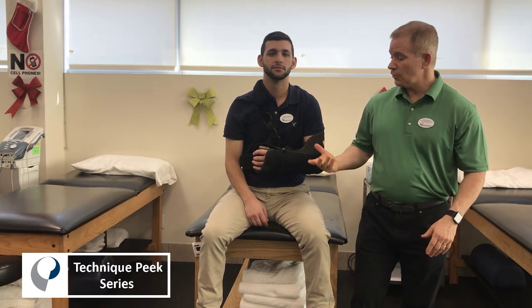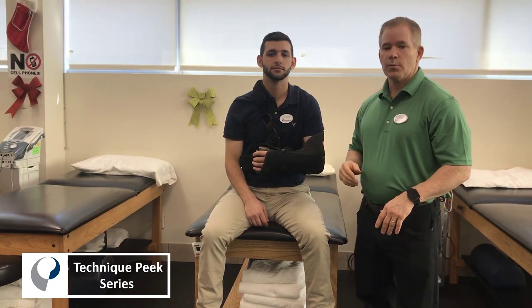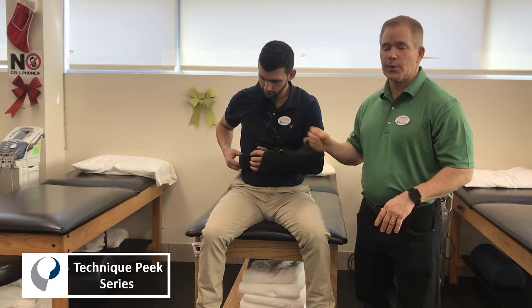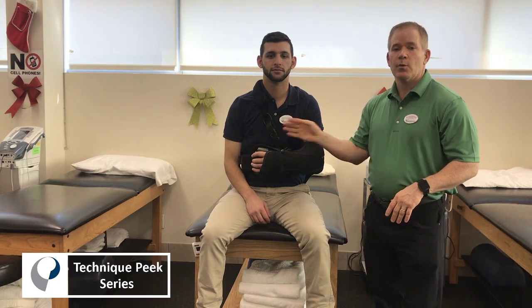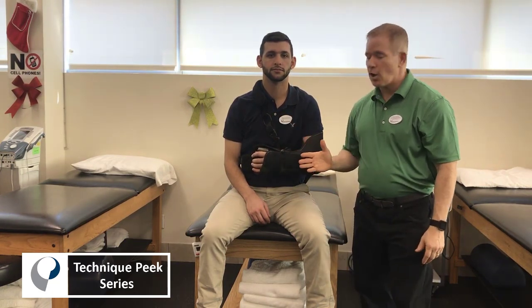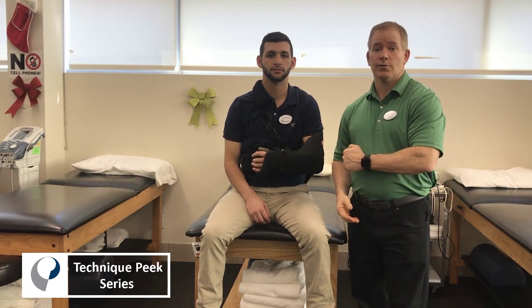As far as taking off the sling, we have the patient start by removing the side strap or the waist strap by unclipping the buckle at the side. The next strap that will be unbuckled will be the chest strap. Notice the position of the arm — the arm should be basically parallel to the floor.